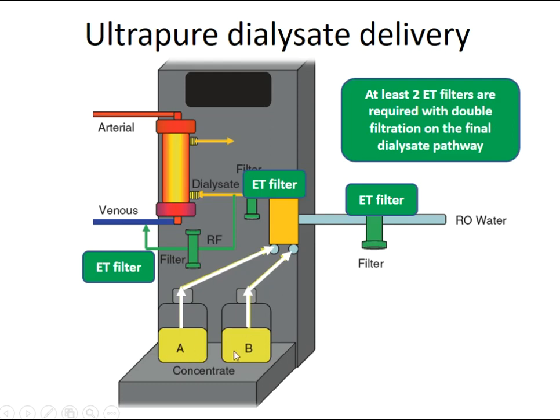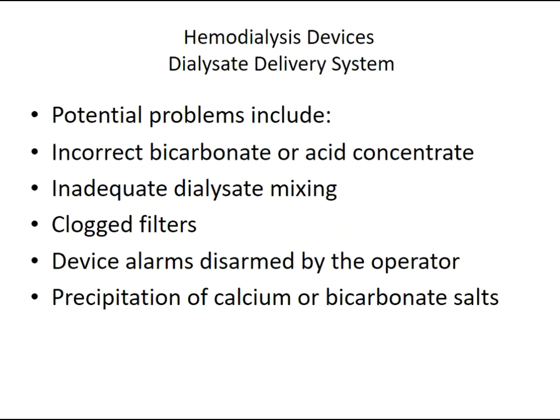From the acid and the base mixing, the dialysate passes through endotoxin filter 1 and 2.